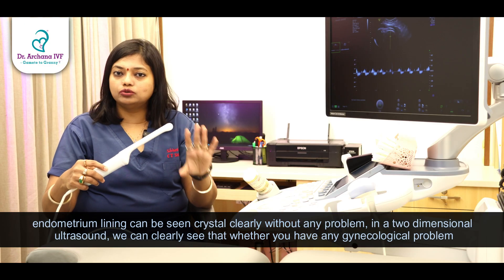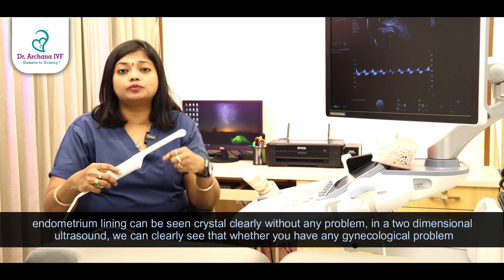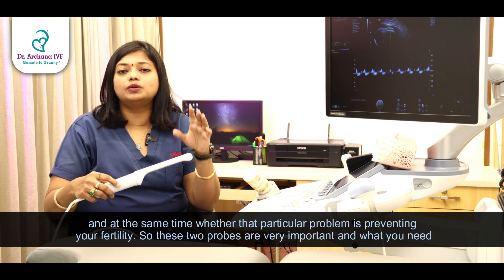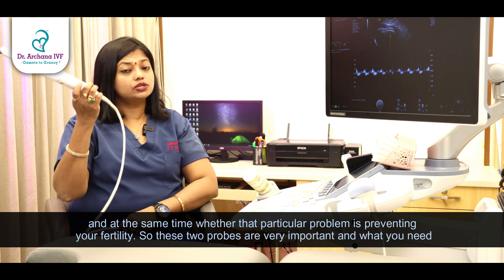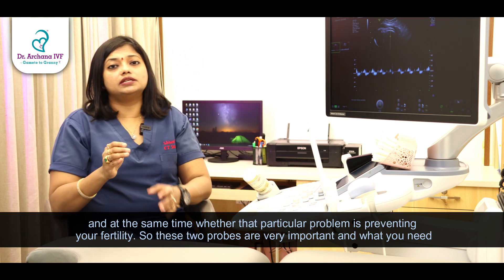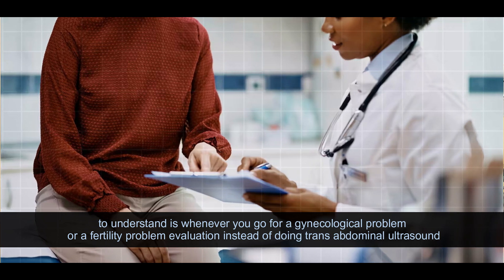Because we have two-dimensional ultrasound, we can address gynecological problems. At the same time, we can also identify problems that may prevent fertility. So these two probes — trans-abdominal and trans-vaginal — are very, very important.